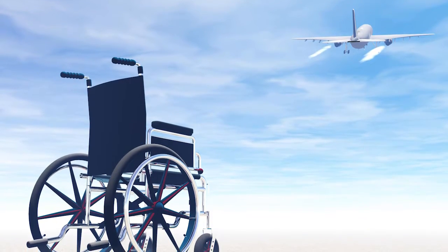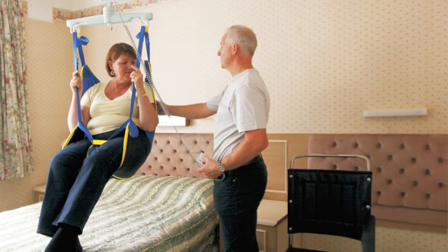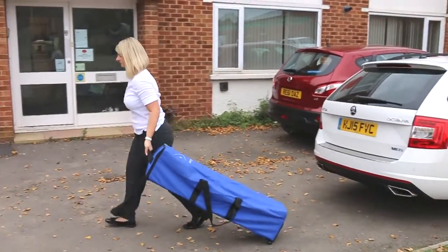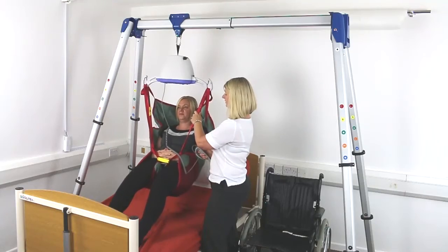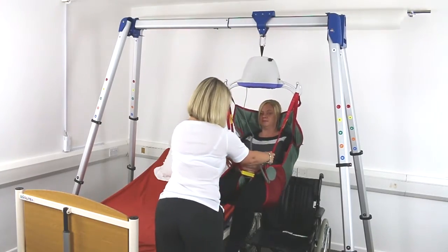Being away from home can be difficult for wheelchair users, especially those who require lifting and transferring equipment for day-to-day living. We aim to help overcome these difficulties with our portable hoisting gantry, which is designed to enable lifting and transferring when away from home.